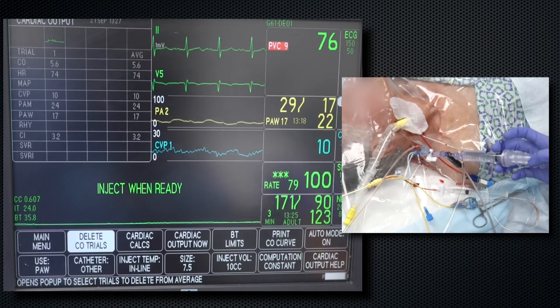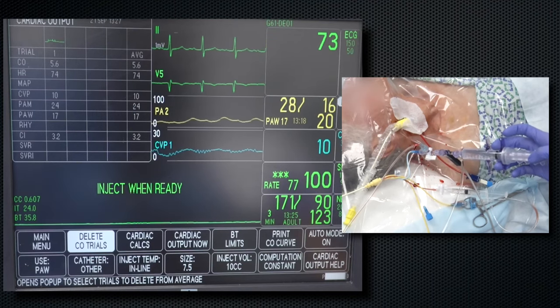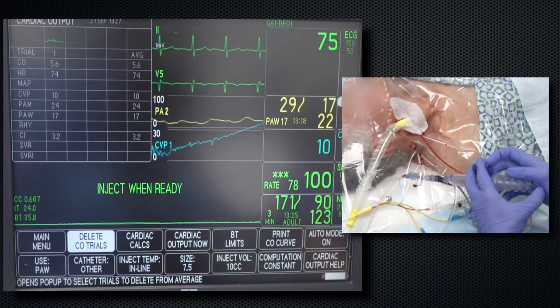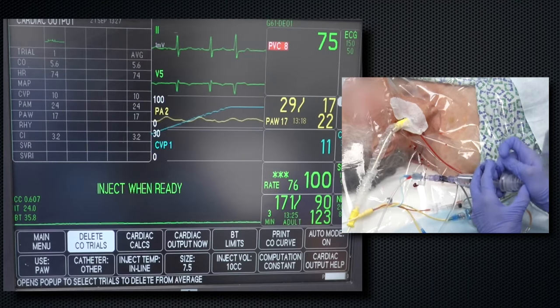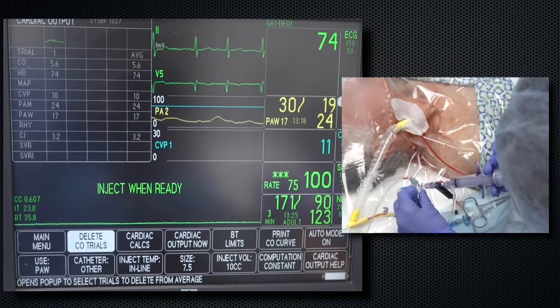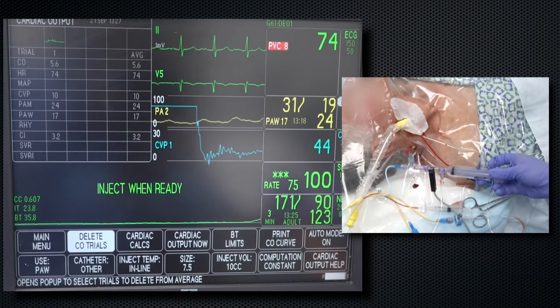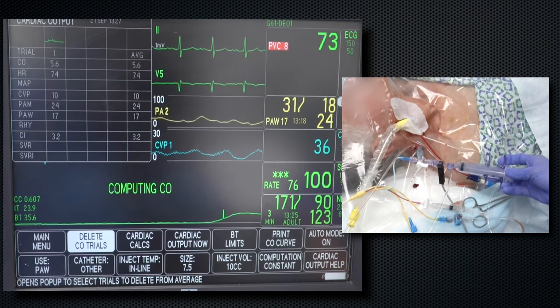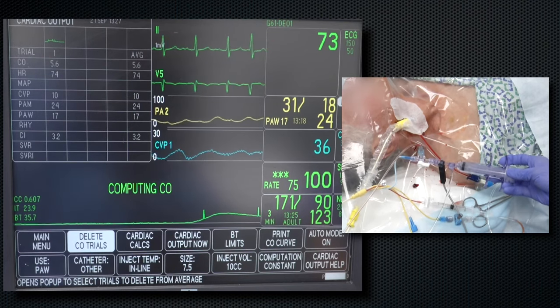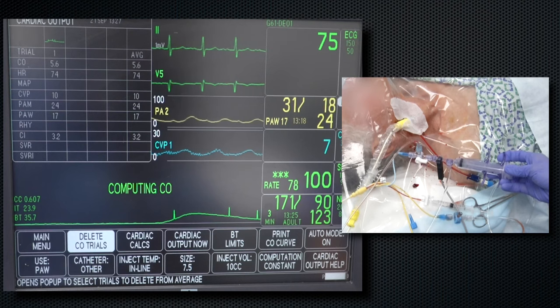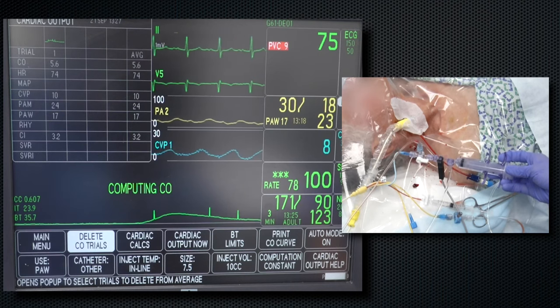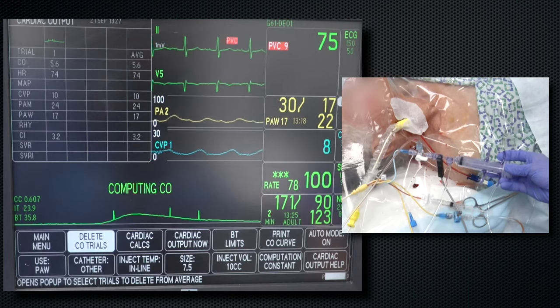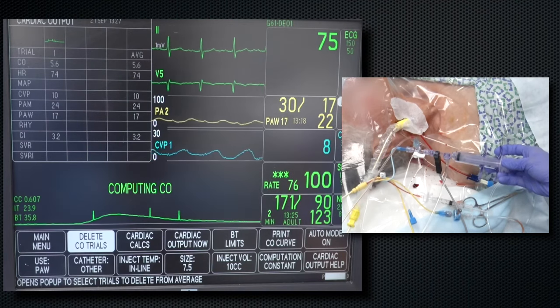Next, set the monitoring software to record the thermodilution cardiac output. Once the monitor indicates that injection of solution is okay, open the stopcock between the syringe and the proximal port of the PA catheter and inject with a rapid but steady rate. The monitor should indicate a graphical change in temperature as it calculates the area under the curve. The larger the area under the curve, the lower the cardiac output. A minimum of three cardiac output measurements should be obtained and averaged.